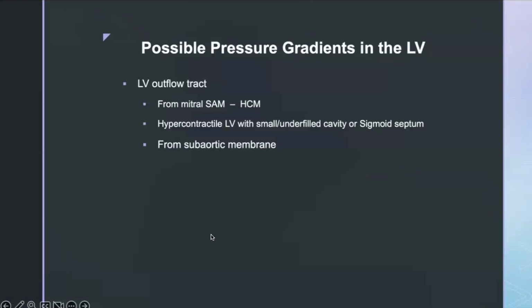So what's your differential when you see a pressure gradient in the LV? This is what I want everyone to have in mind as we go through. The first is LVOT obstruction, and that's what we're most commonly used to seeing.